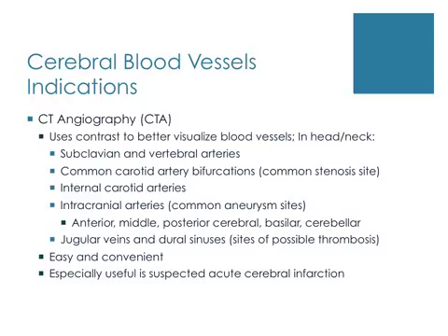After a non-contrast CT head is performed to rule out a hemorrhage or bleed, a CT perfusion at the level of the suspected infarct is obtained to delineate the amount of brain at risk for permanent damage. So once that CT head without contrast is done, then a CT perfusion scan can be done. A CTA of the cerebral vessels will sometimes follow to identify the presence of a clot in a major intracranial artery before a clot-busting drug is administered. These clot-busting drugs are commonly known as thrombolytic agents, and you may have heard of them in the clinical field.